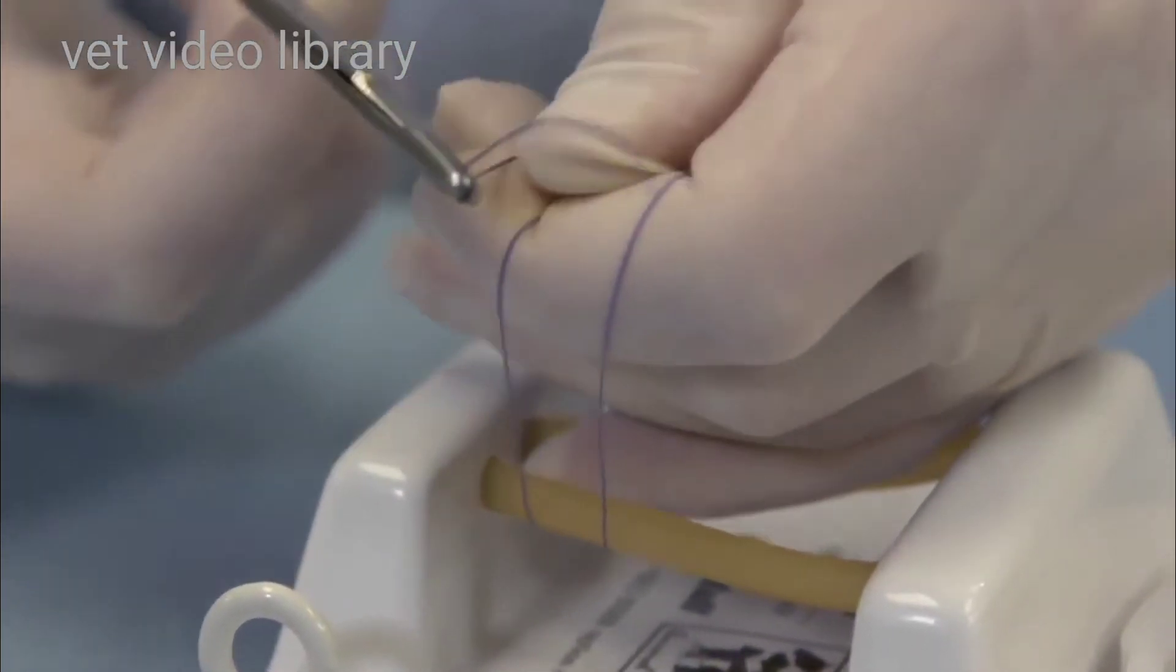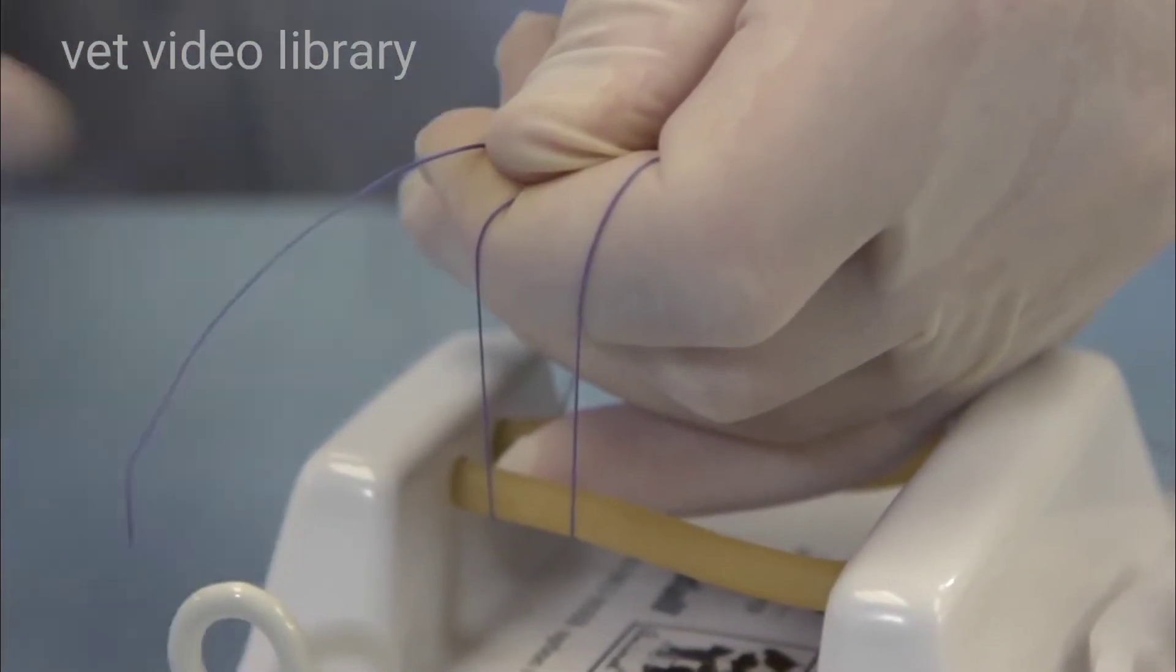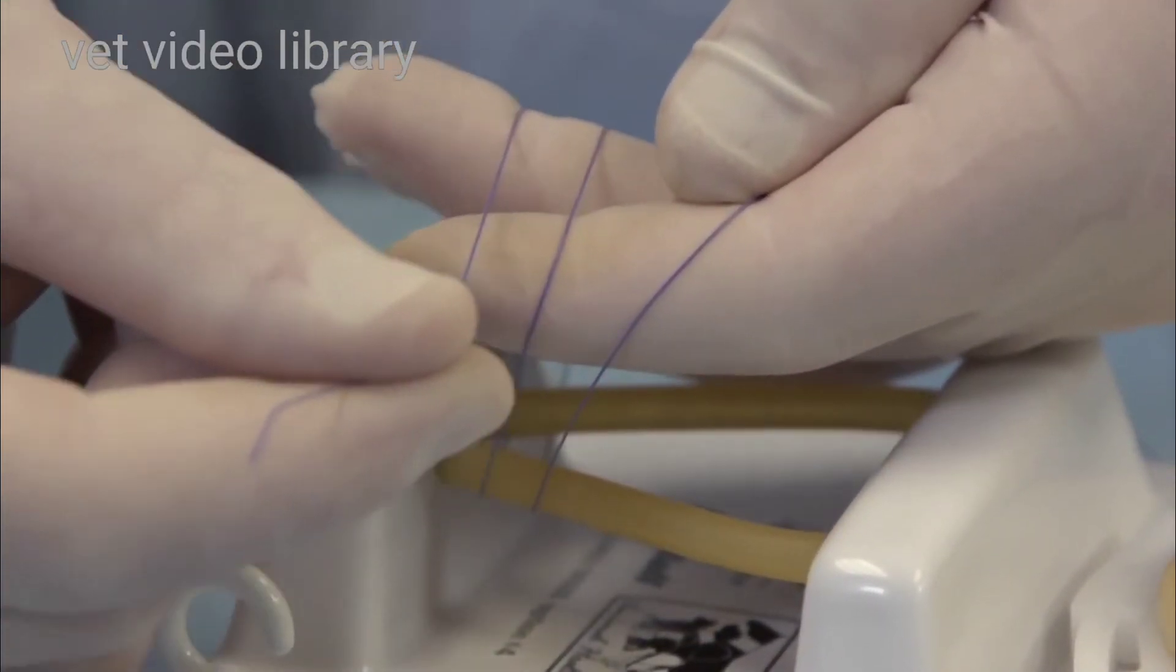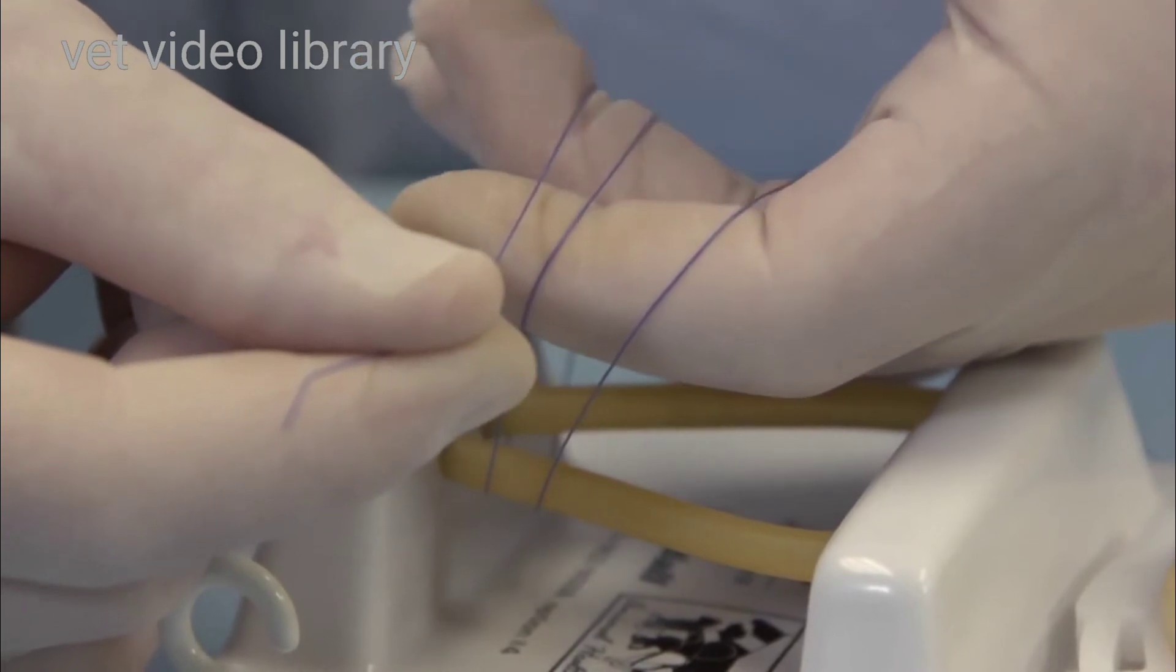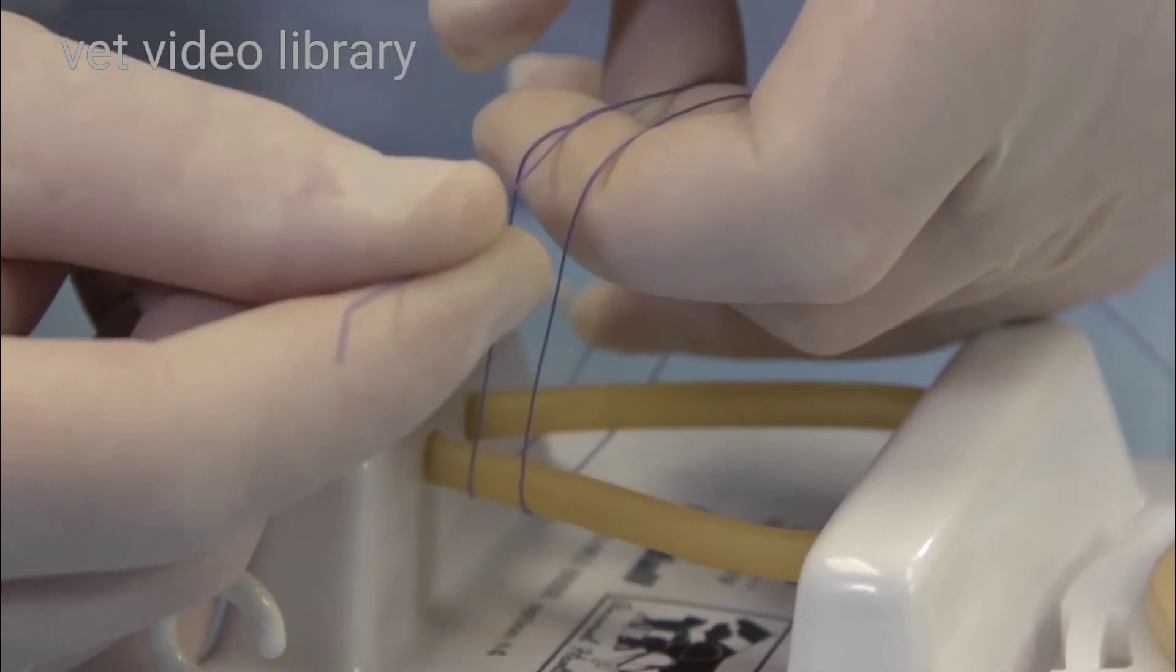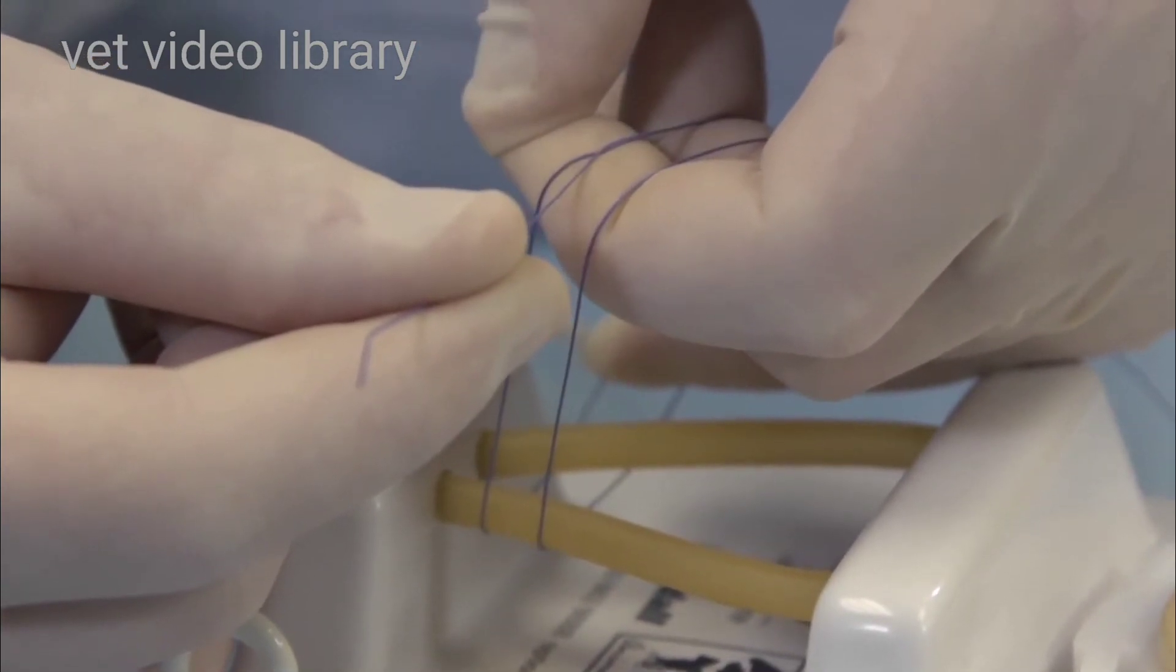I now have three strands of suture. I'm going to take my thumb, I'm going to make it meet my index finger right here. Just make it meet that.